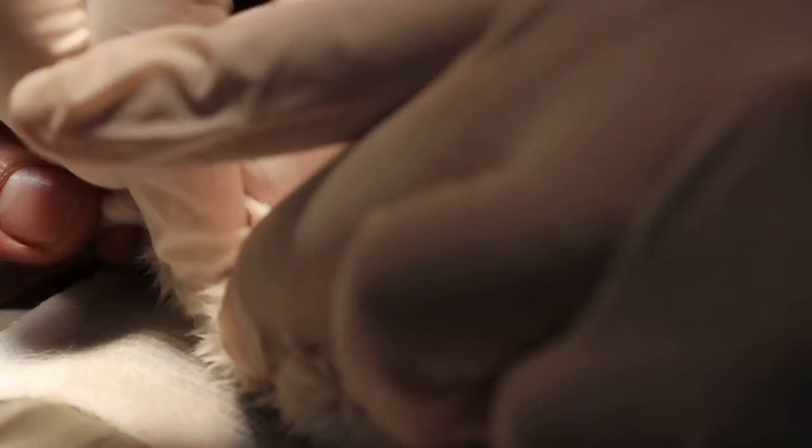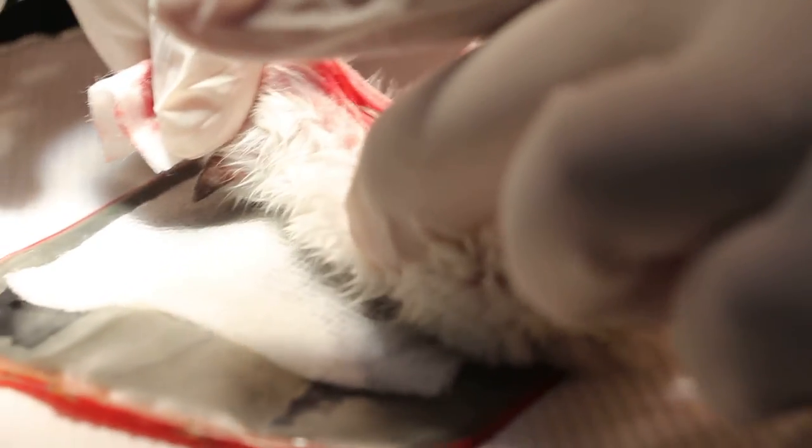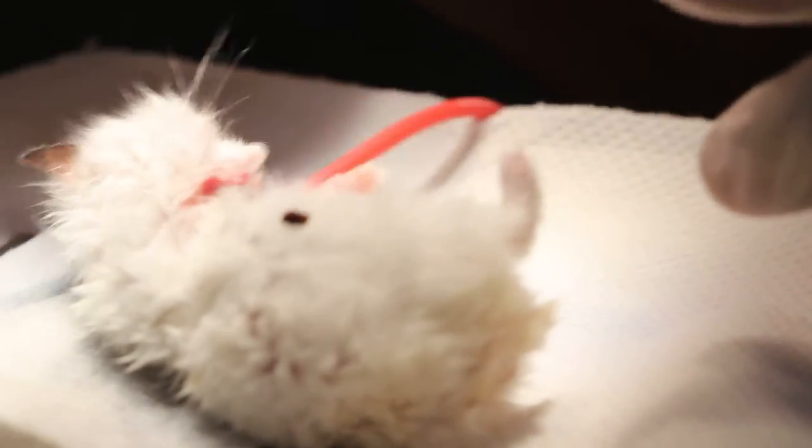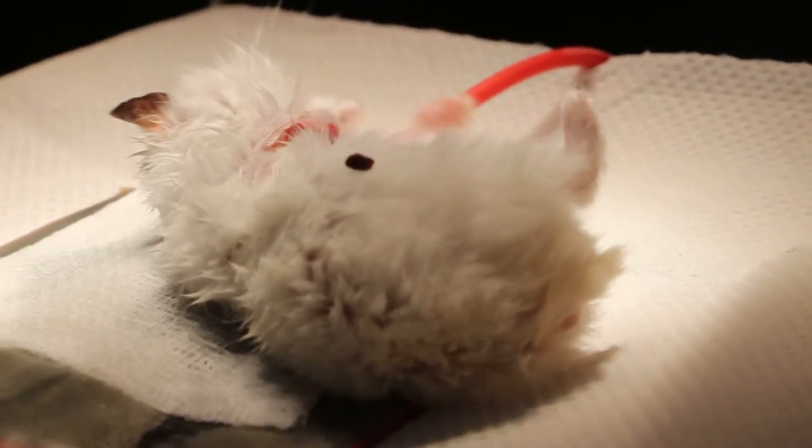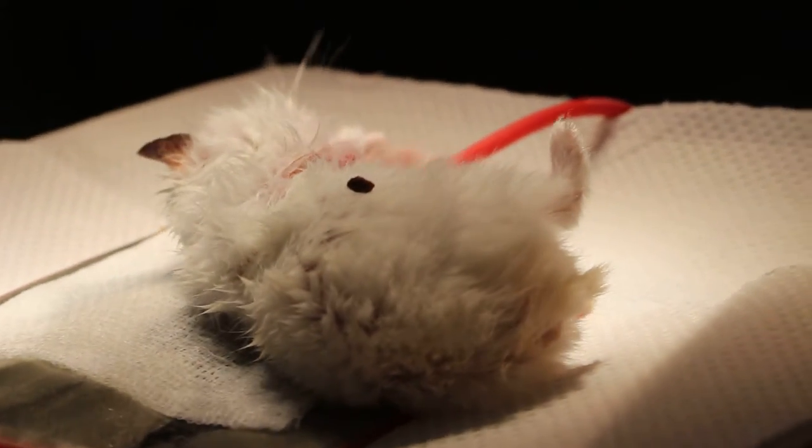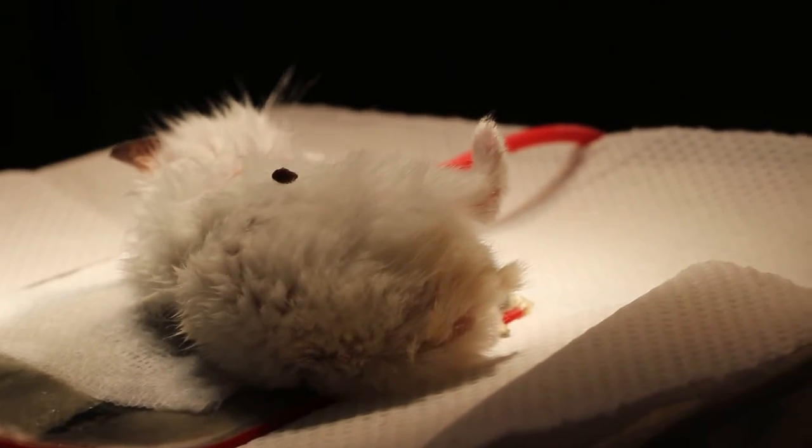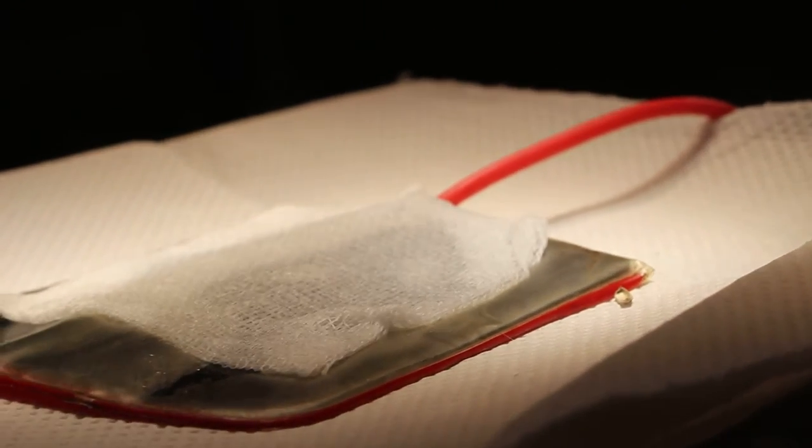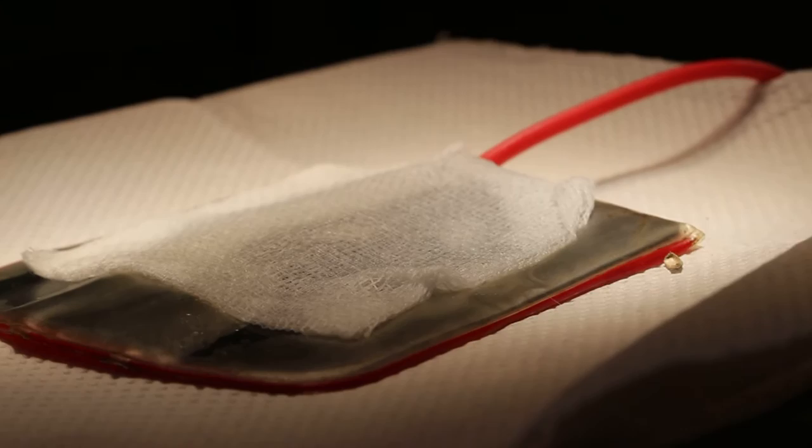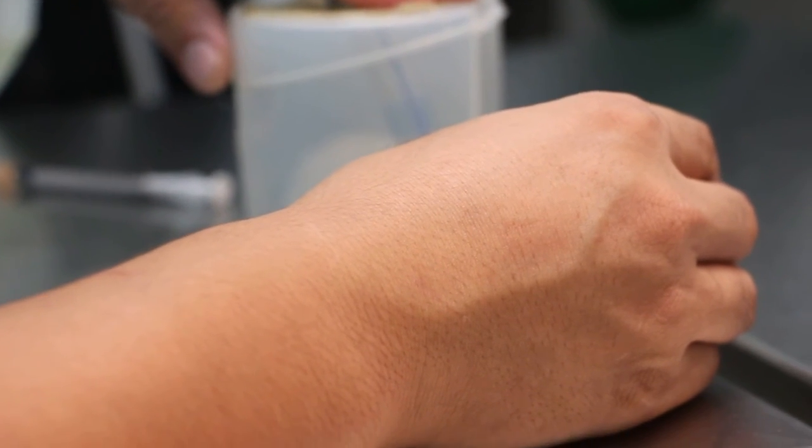There's a big hole here under the armpit which needs to be stitched up. I'll give a bit of gas here. About five seconds or not, it's not a long time. I did this already, okay, right now.